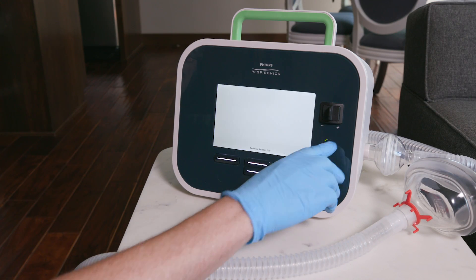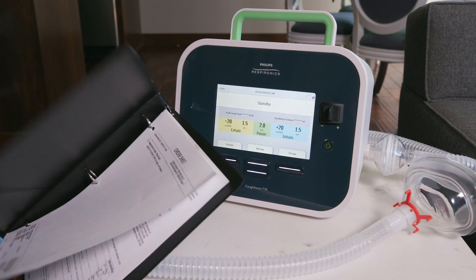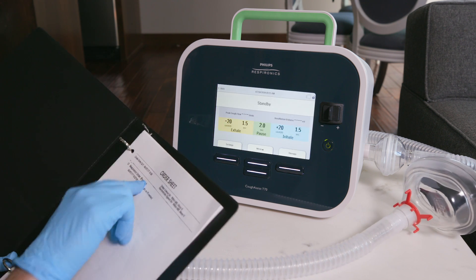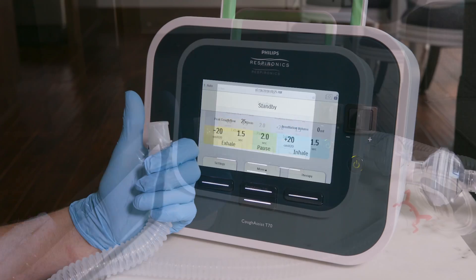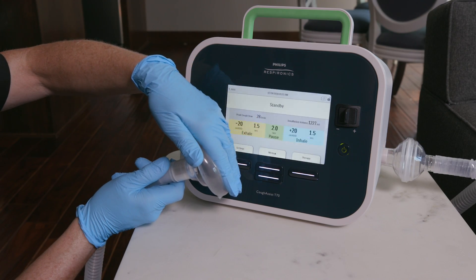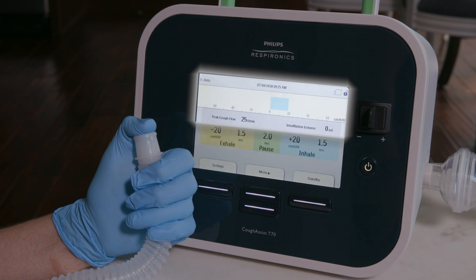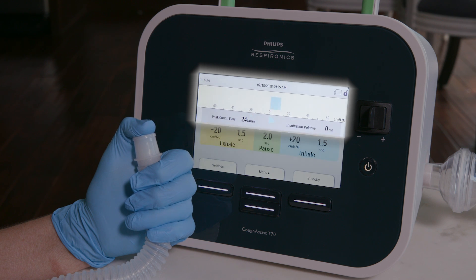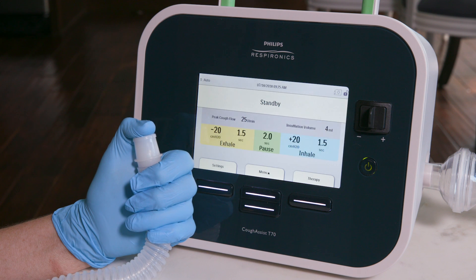Turn on the cough assist machine. Check that the settings on the device match those prescribed by the healthcare provider. Block the end of the tubing or cover the mask with your gloved hand and push the therapy or start button. You should see both positive and negative pressures on the display screen. Once you see both, the check is complete. Push the standby button.